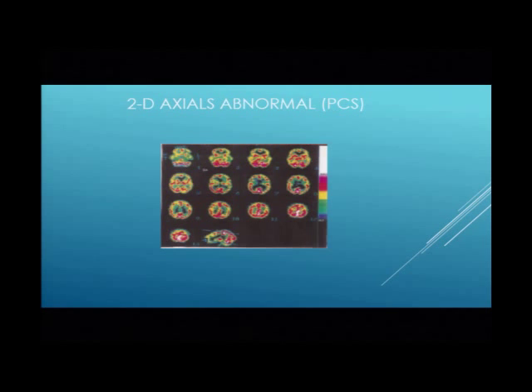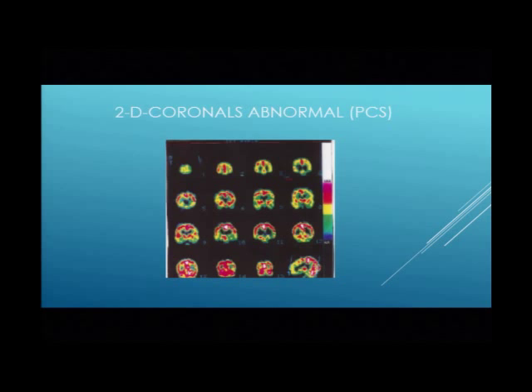So you can see this is all hodgepodge and doesn't look anything like what we saw on the other. So here's the other view. These are the slices from the front to the back. And remember what I said about this view here? I said it's supposed to look like a ring. Look at the progression of the colors. The top is red, on the side it's yellow. Well, here's yellow. And look at the bottom, it's green. And it looks like it's worse on the left than the right.